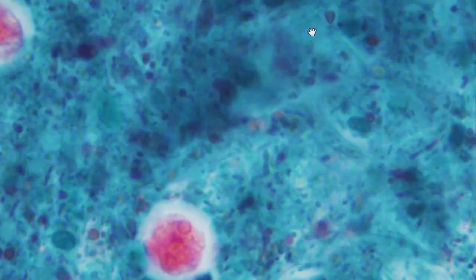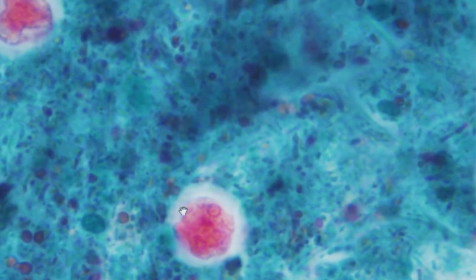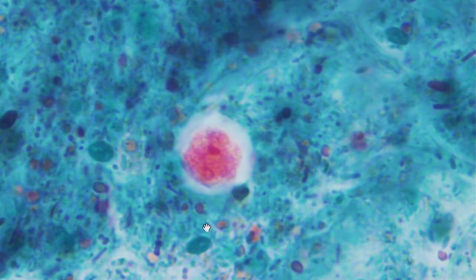Now in this part of the stain you'll see a lot of Entamoeba. They're all cysts, but they've crunched up a little bit and they've stained red, which is actually unusual for this kind of stain. Obviously this particular stain wasn't tremendous, but there are some things I want to show, and in other parts of the stain they are not red, and I'll show you what they should normally look like.